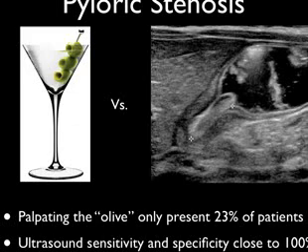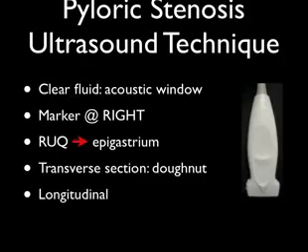And if there's a lot of bowel gas, if the patient has a bowel obstruction, there's a lot of bowel gas everywhere, this can be a somewhat difficult study to do. And if they've been crying a lot, sometimes they swallow air, and we know air is the enemy of ultrasound. So instead of being nice fluid in here, or formula, whatever this is, there's air in there, and that can get in your way. So that has a couple of limitations. But a lot of times when the child vomits, a lot of gas comes out of the stomach, and we actually get rid of that air. So vomiting can be a helpful thing when doing ultrasound.